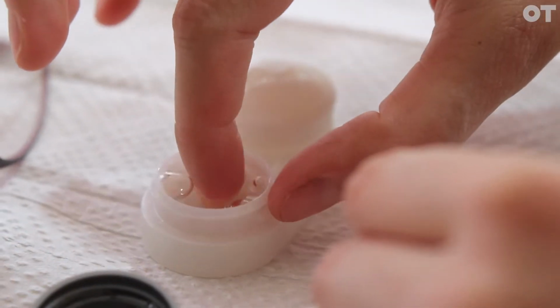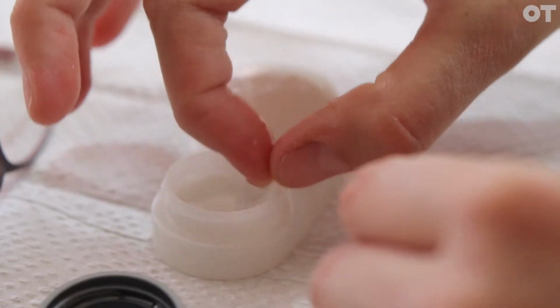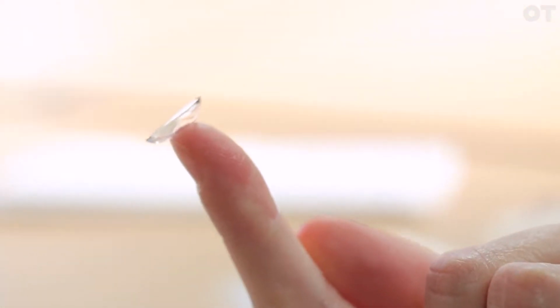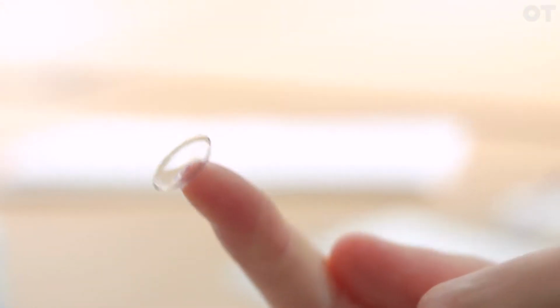To get familiar with brands, it's probably a good idea to order in some trial lenses and try them out. See how they handle, put them in and out on yourself, and just see what it's like, feel what they're like. I get a little bias towards lenses that I personally find comfortable, and it means I end up recommending them to patients probably more. But then it depends, you know, one will have UV protection and that person is a tennis player and they're going to be wearing them outside a lot and you want the UV protection maybe. So there's different things to think about across each brand. So it's really horses for courses. You've got to tailor your recommendation to that person.